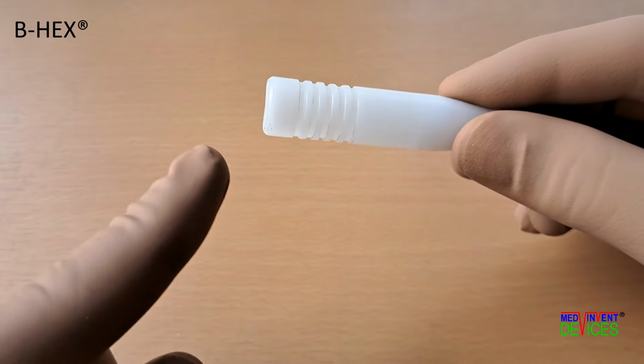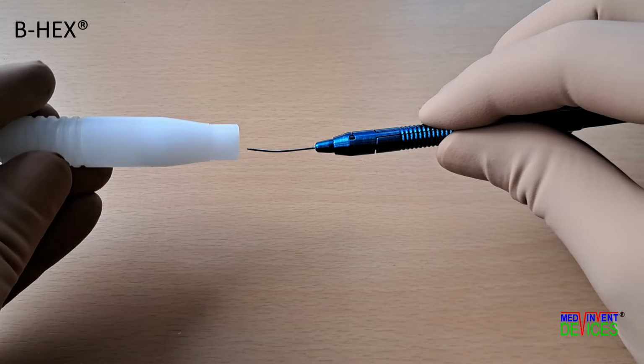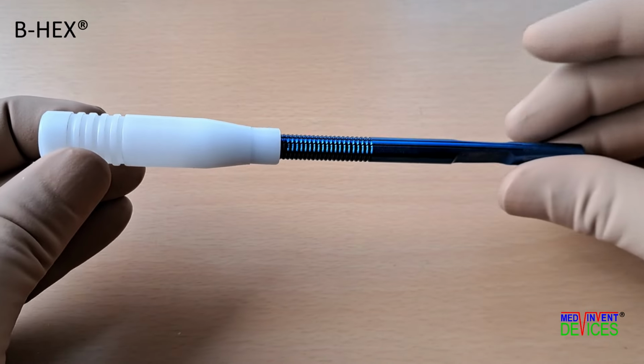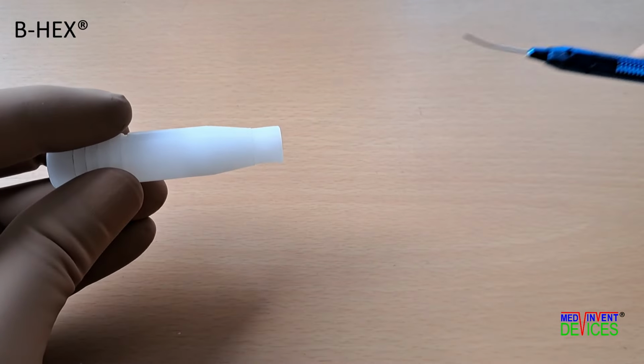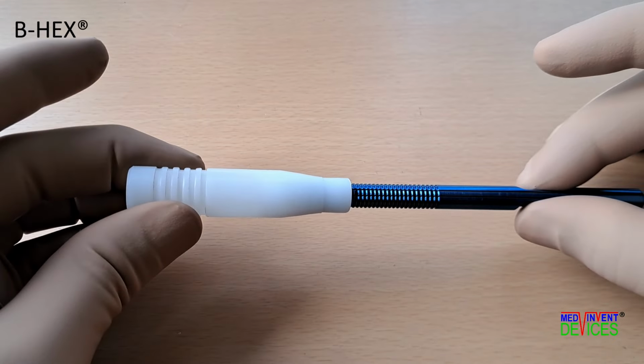The cap has a funnel shape with a wide end and a narrow end. The B-HEX forceps should be capped as demonstrated here, to ensure that the delicate jaws and stalk are not damaged. The narrow end is always slid over the forceps jaws first.